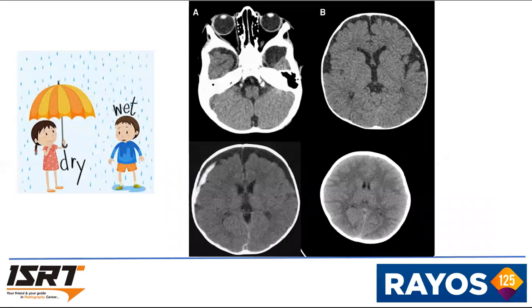And take your time to get involved with the pediatric brain slices as well. The pediatric brain appearance altogether is different from the adult brain. So take your time to get familiarized with how the pediatric CT head appears.